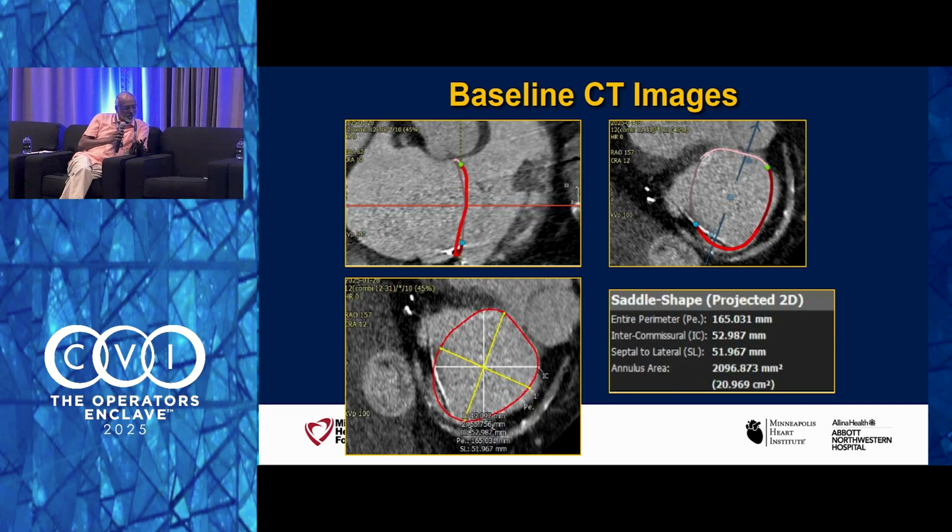And that's not easy. One of the things we have found, and it's being published, is a simple 2D index, because that's the easiest thing to do: septal flattening in systole, not in diastole, but in systole. If there is septal flattening in systole, that RV is almost gone, and it's never coming back.